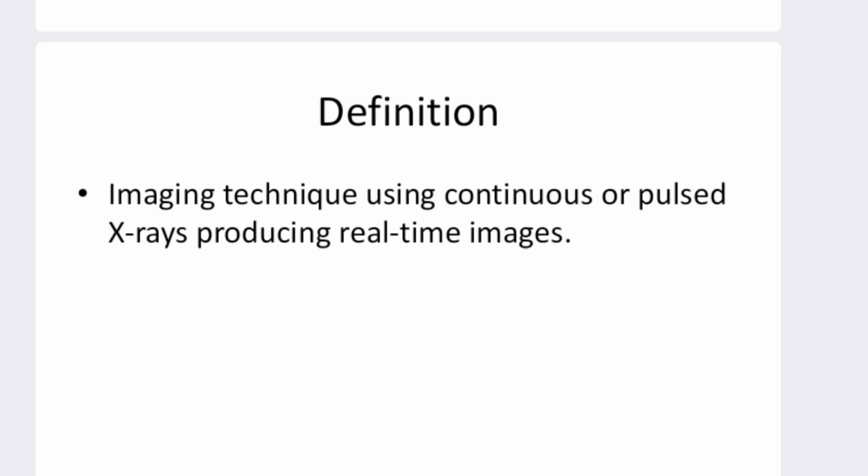Usually, fluoroscopy is a method of obtaining a radiological image on a fluorescent screen or phosphor. This imaging procedure gives a live X-ray image of the patient, and real-time moving images of the internal structures of the patient are obtained by the use of a fluoroscope. The radiologist views the images of the moving organs continuously while the X-ray beam is on.